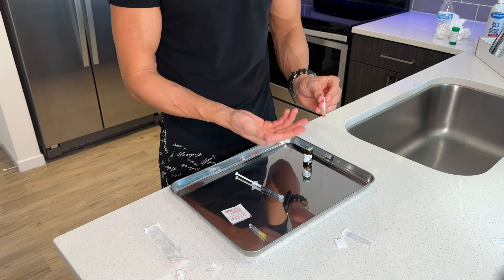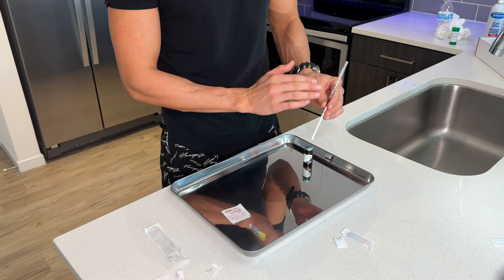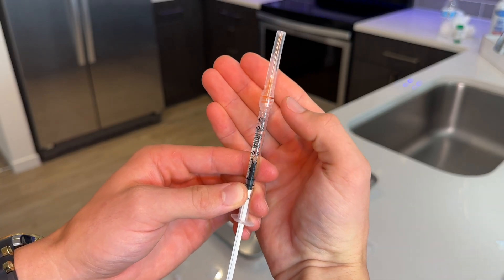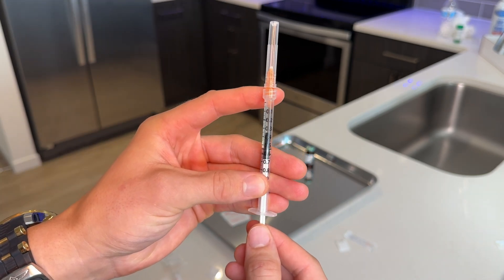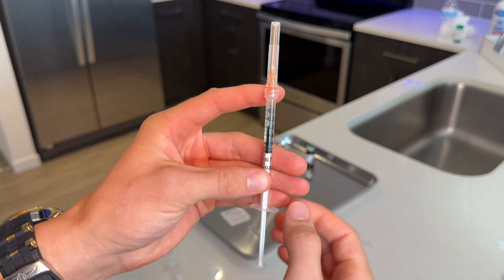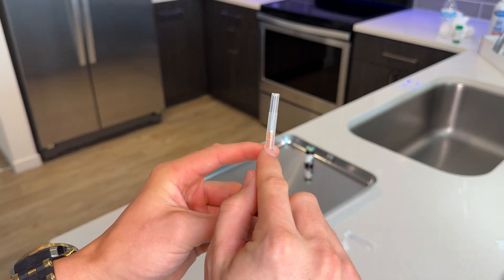In my case, this is a 25 gauge one inch needle. I inject intramuscularly into my glutes and this works perfect for me. Screw on the new needle. Now, here's the trick to preventing bubbles with your injection. As you can see right now, there's a little bit of air trapped in the syringe, so we're gonna wanna move the liquid up to the needle. You'll be able to see the liquid go up into the needle and squirt out just a drop at the top. At this point, look at the top of the needle to make sure there are no bubbles.